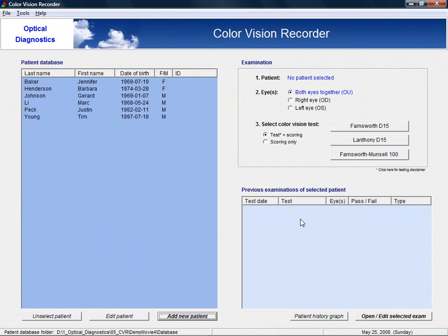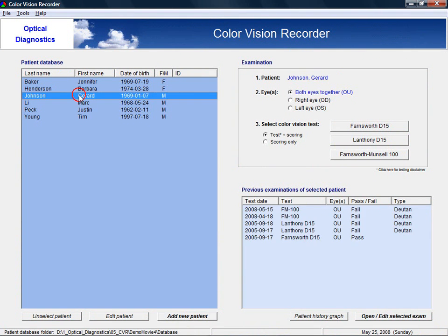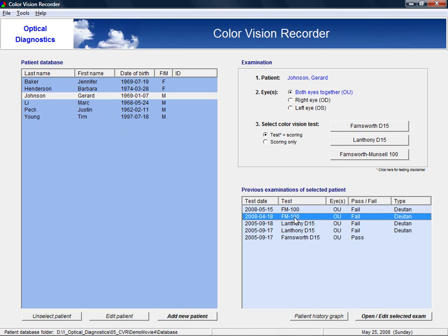With each patient, a series of previous color vision examinations is associated. After an examination has been selected, it can be opened to view or edit the test results.